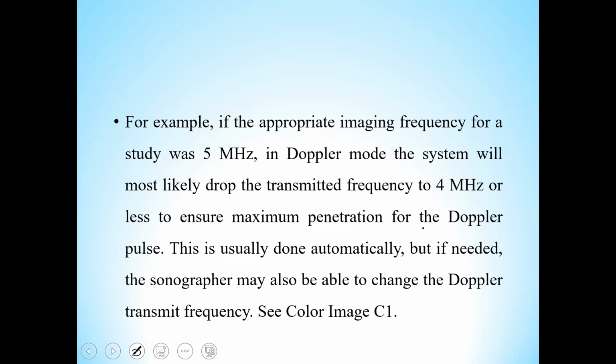This is usually done automatically, but if needed, the sonographer also has control over the knob to change the Doppler frequency.